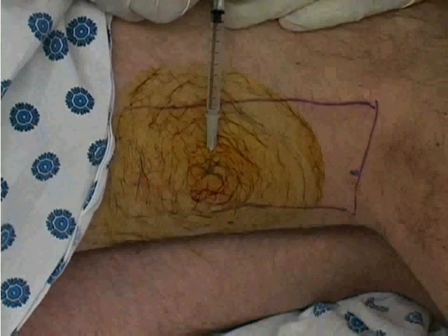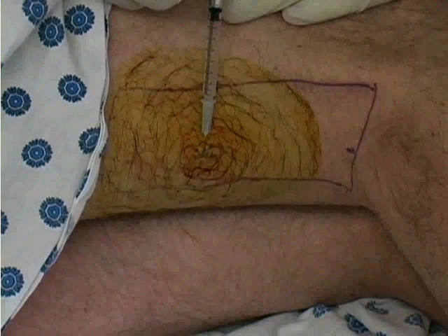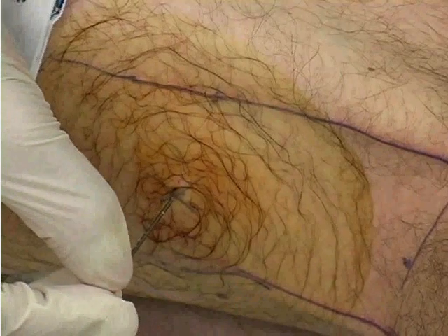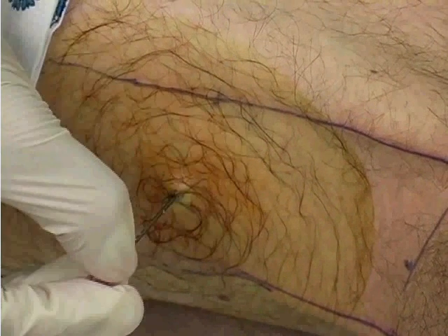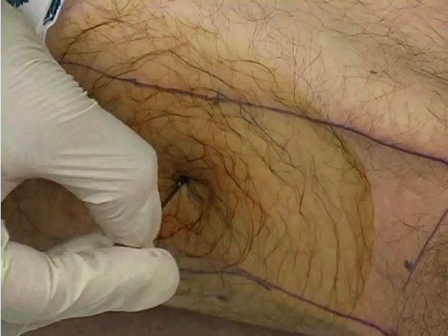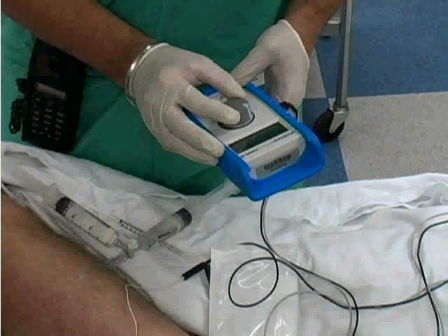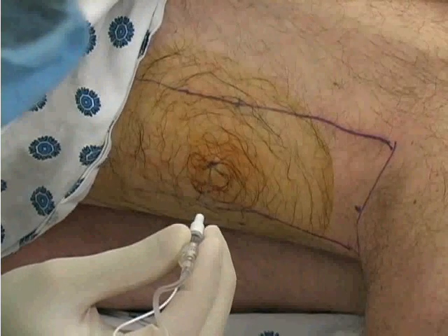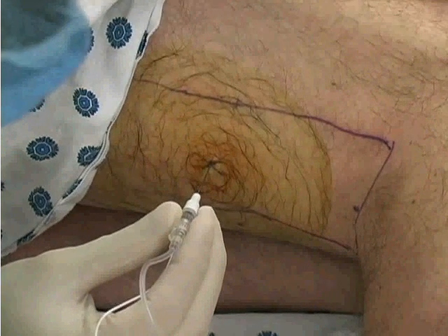Using the tuberculin syringe, create a skin wheal with the 1% lidocaine in the cutaneous tissue over the insertion site. Prior to inserting the stimulating needle, use a beveled needle to puncture the skin. The puncture site will allow the blunt tip of the stimulating needle to pass easily through the skin. Turn on the nerve stimulator and set the dial to generate 1.5 milliamps of current. Holding the needle perpendicular to the skin, insert the needle slowly at the previously marked needle insertion site.